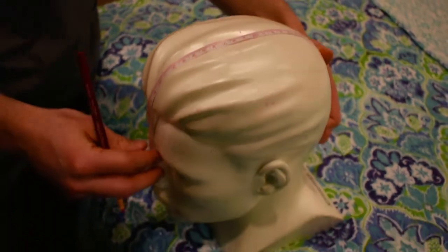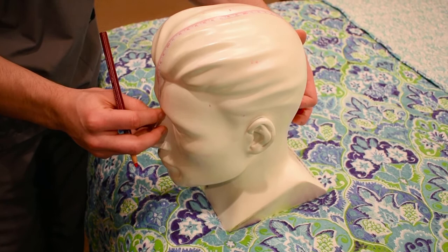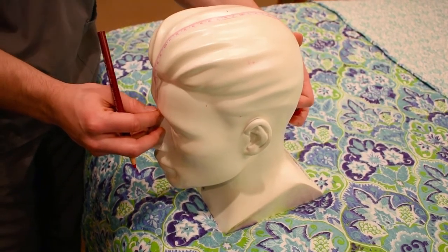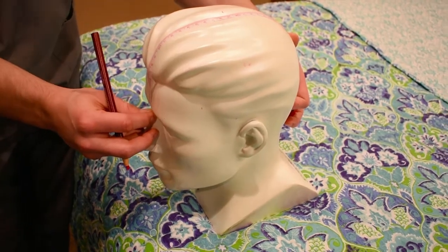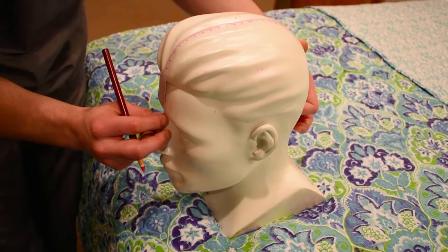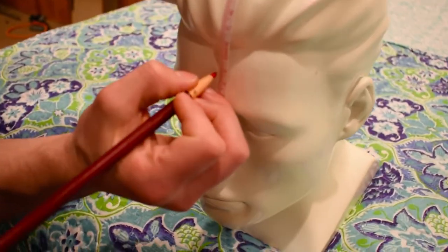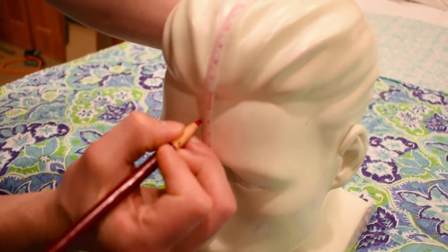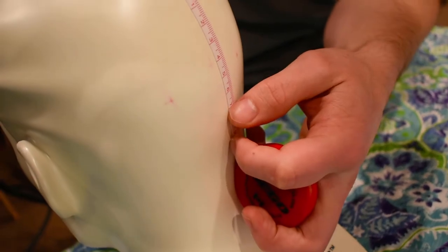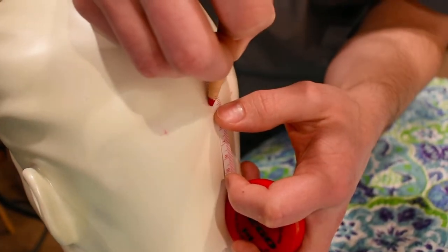And then what we also want to do from the nasion to the Inion is measure 10% of that distance up from the nasion and up from the Inion. So 10% of 38 centimeters is 3.8 centimeters. We're going to do this in the front and the back. So 3.8 right here, and then in the back, 3.8 right here.